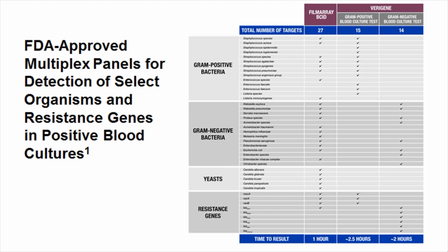The BCGP and BCGN panels use the Verigene system, consisting of 2 components: the Verigene Processor SP, which provides automated sample preparation and detection of bacterial DNA in a microarray format using gold nanoparticle probe-based technology, and the Verigene Reader, which generates results based on light scatter analysis from microarray spots.